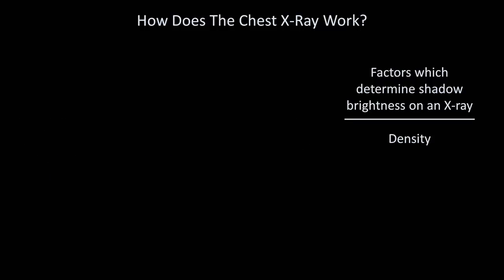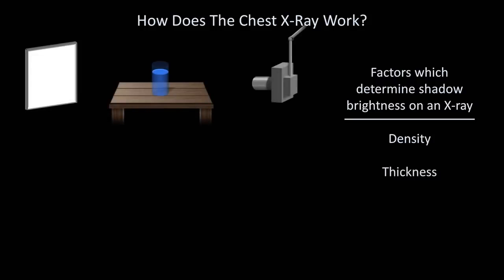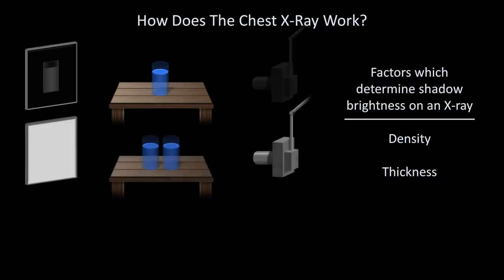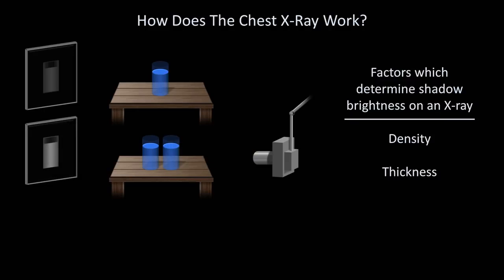The next factor which determines shadow brightness is the thickness of the structure being X-rayed. If we take a single, relatively thin glass of water and expose it to X-rays, most will pass through, resulting in a very dark image on the film. If instead of one glass of water we line up two glasses in a row and shoot X-rays through both, twice as many will be blocked. The resulting image will therefore be more gray because the specific part of the film corresponding to the shadow of the glasses have been relatively less exposed.